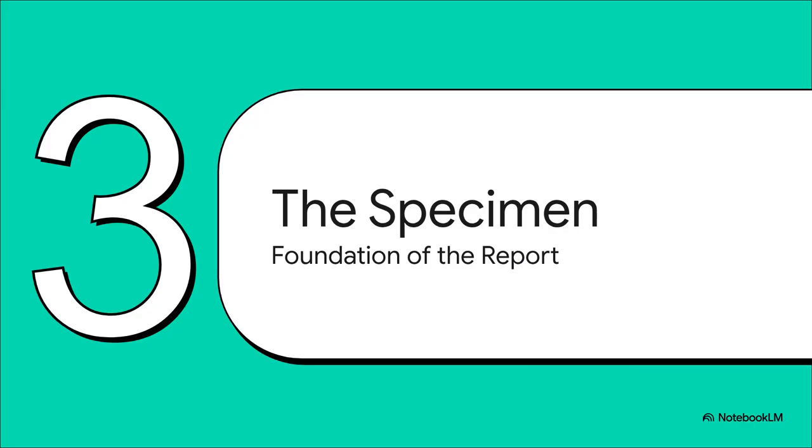All right, let's get practical. Every single great report begins with the tissue itself. Before you even think about genes or proteins, the CAP template makes you stop and assess the quality of the specimen you're even working with. This is the foundation, and if the foundation is shaky, the whole report is useless.